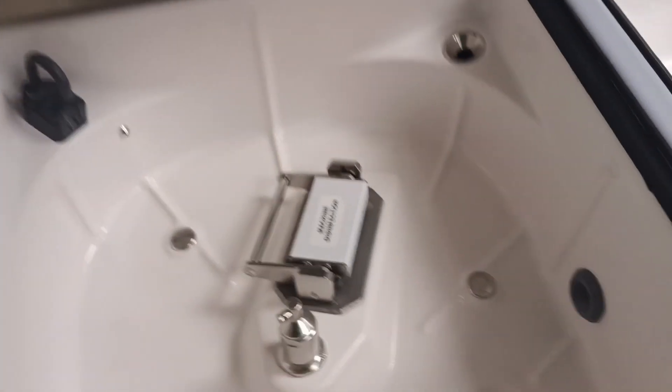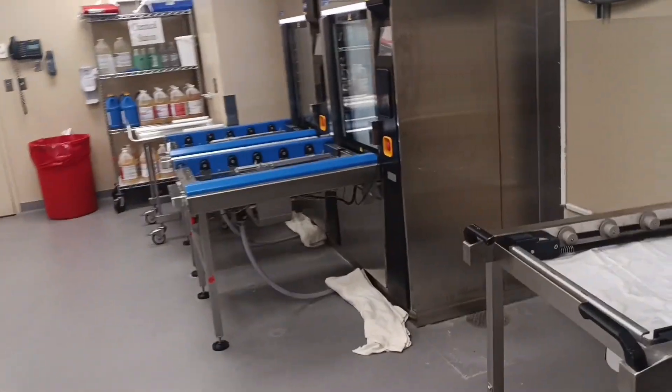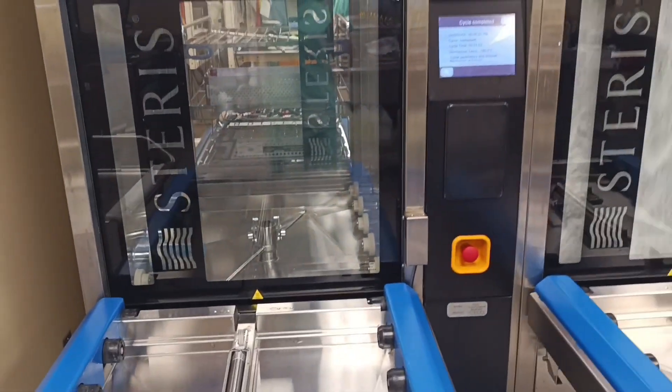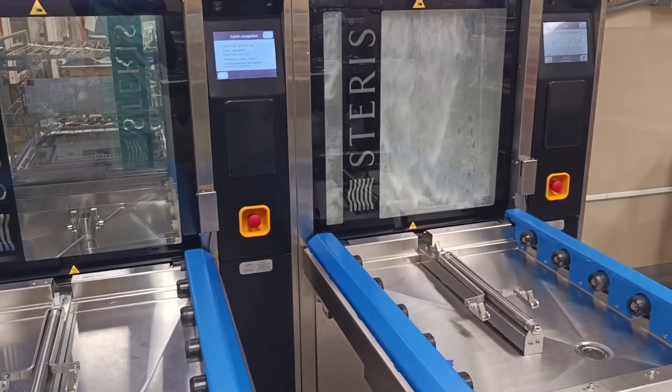So this right here is a Merivero. This is where all the scopes are being cleaned and processed — yep, this is what it looks like. I'm just going to show you what the whole department looks like. And this is the wash where all the instruments go through. In other hospitals they look different, but it still serves the same purpose, which is to wash instruments.